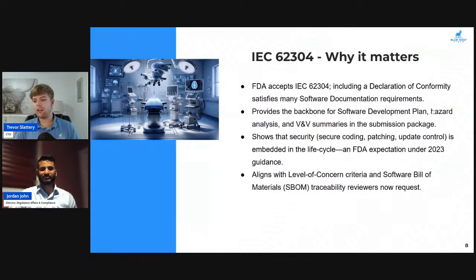So it sounds like all of these can tie together in a way. You mentioned that process where we're talking about the design, moving into the assessment, moving into the risk management. And so it seems like all of these should essentially integrate together instead of being thought of as clearly distinct processes. Since we just talked about risk management, identifying these risks as we're going through this V&V should get fed directly into there, is sort of what it sounds like.